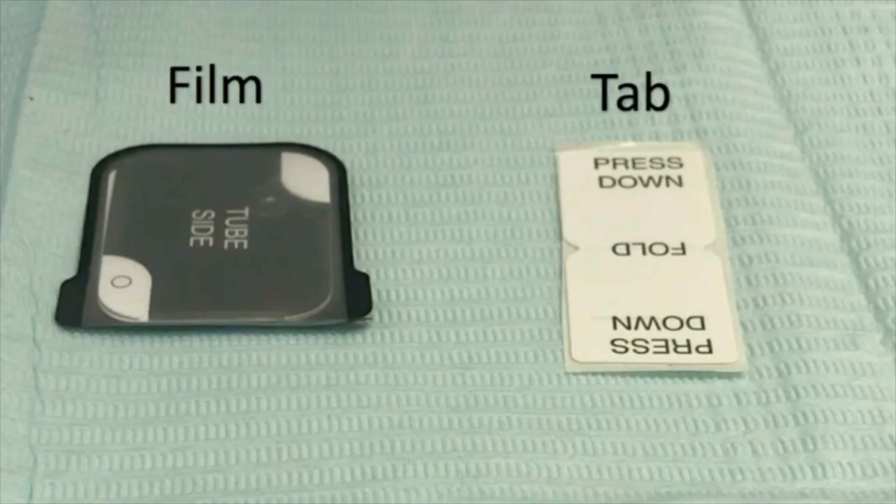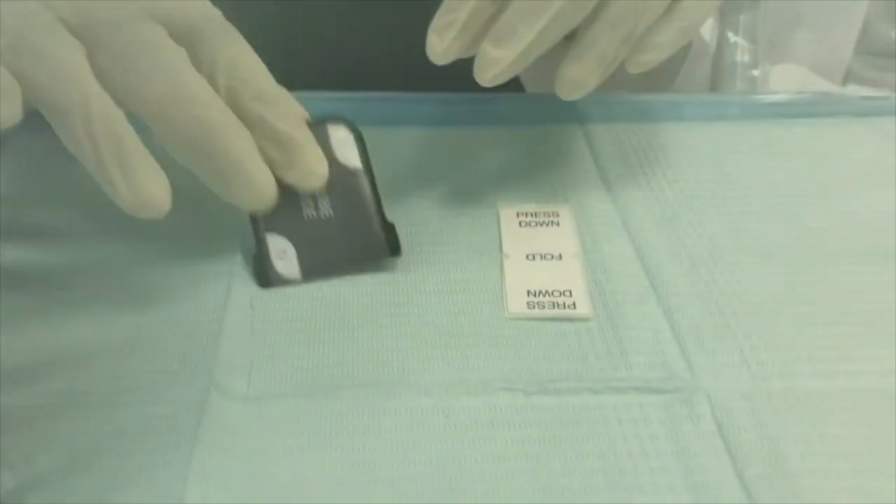Hello everyone, my name is Mira Ruzugi. I'm a dental student at the University of Sharjah. Today we'll demonstrate how to take bitewing radiographs.